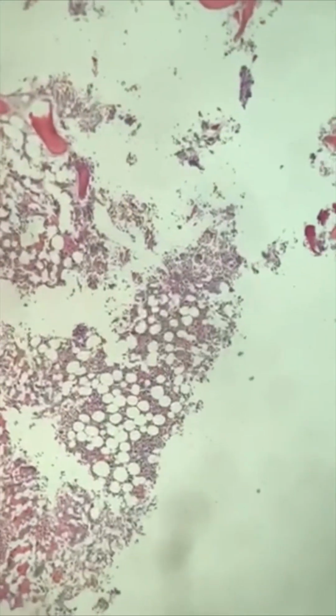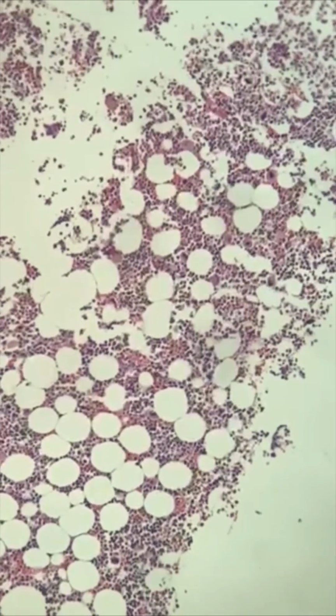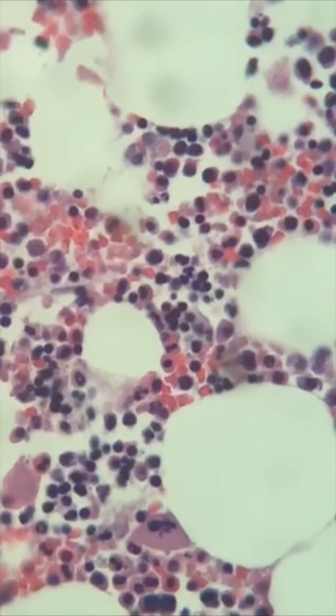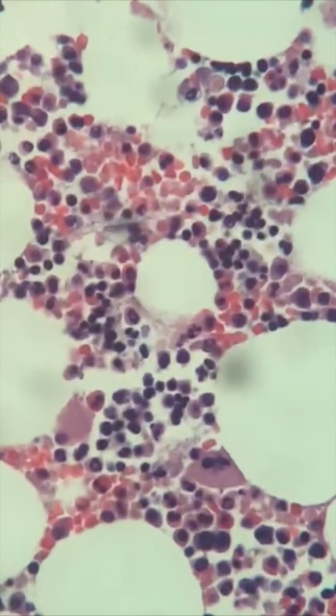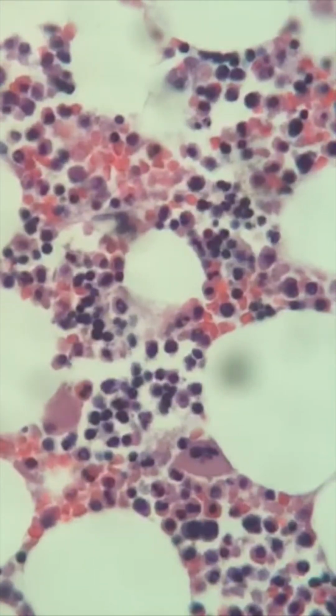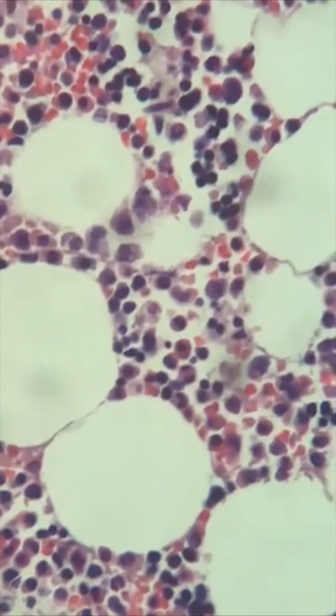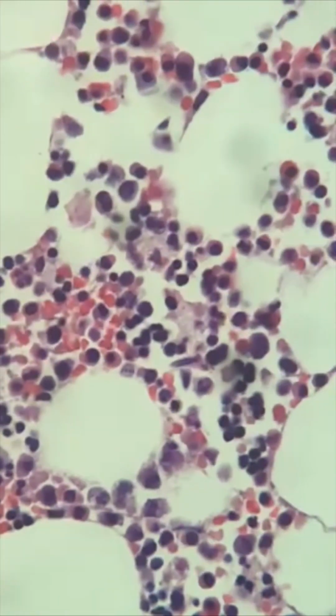And finally, I take sections of bone marrow. You can see that this person obviously had adequate cellularity, and I'm going to go down into a more cellular area like in here. That's a good section to look at bone marrow tissue. And you get people saying, oh, you can't examine bone marrow that well on telepathology. Well, you see here that you can see bone marrow cells without even oil immersion. You can see nicely the marrow elements: megakaryocytes, myeloid cells, erythroid cells. They're all here, normal in amount and morphology.